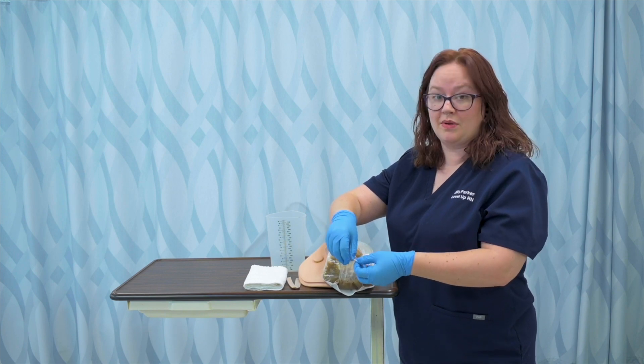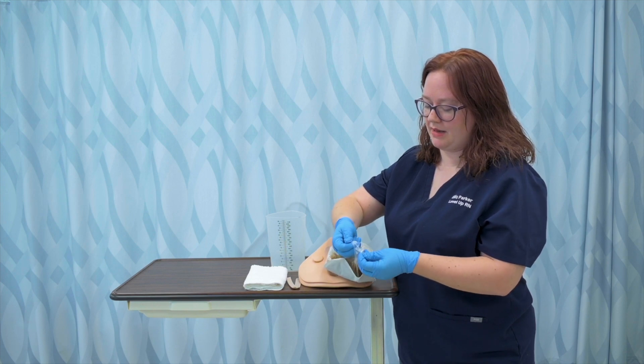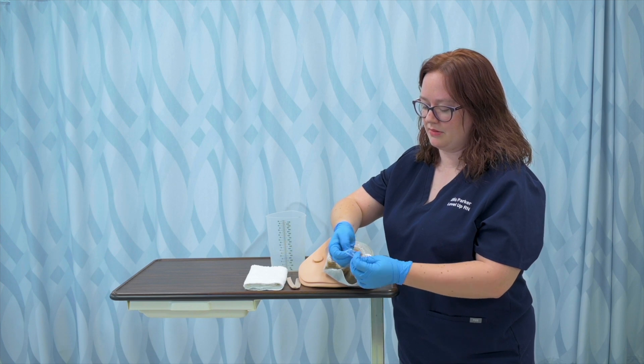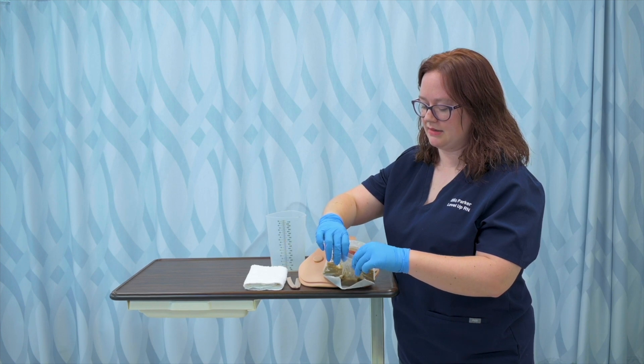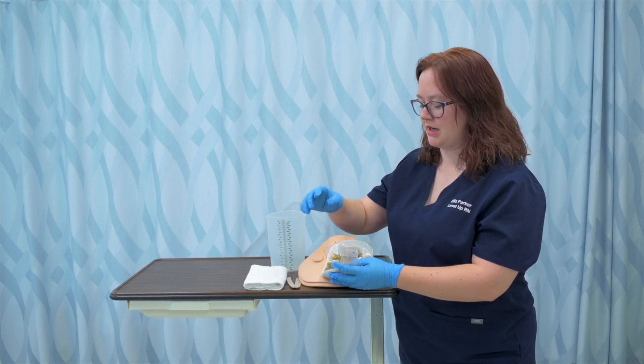Some are velcro, some you don't empty and you just change the whole bag. But this one has a clip and I'm going to roll the end of this bag down a little because when I allow the waste to exit, I don't want it to touch the outside of the bag and potentially get on anything else.